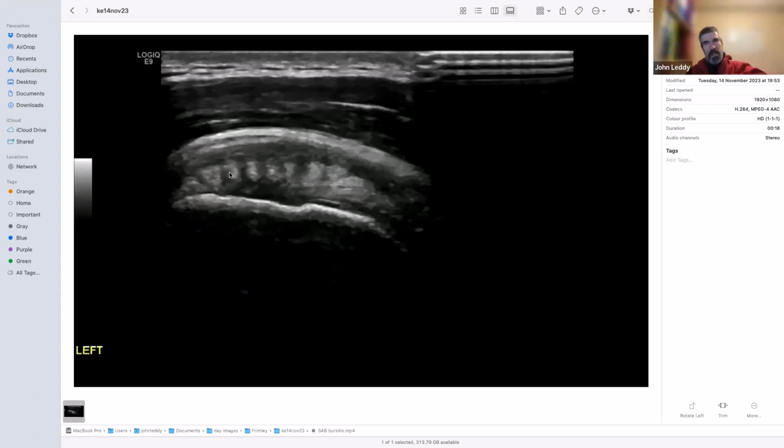There might be some fibers crossing over or continuous with, as you see a lot of these fibers spread out as they approach the insertion, and that might be quite close to the end. I suspect that doesn't really happen, even this, which is probably a centimeter or something like that. In tendon terms, that's quite a big distance, because certainly on ultrasound at the macroscopic level that we're looking at here, the tendons are separate and going in different directions until probably very close. But that's somewhere where I disagree with what I see published. But the devil is in the detail, and would probably not.